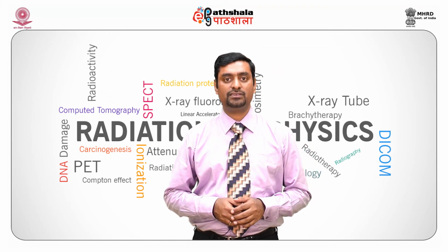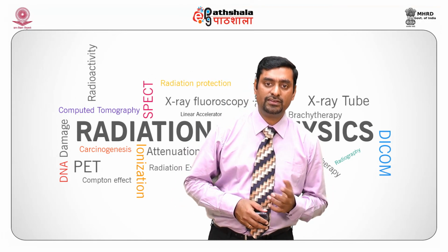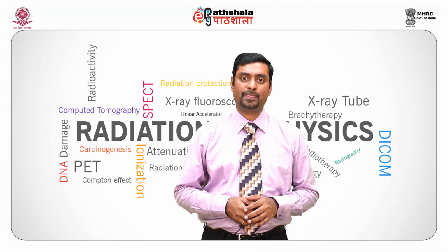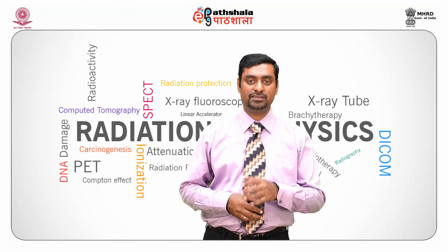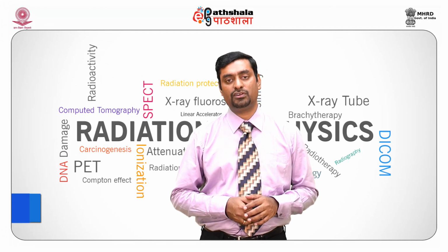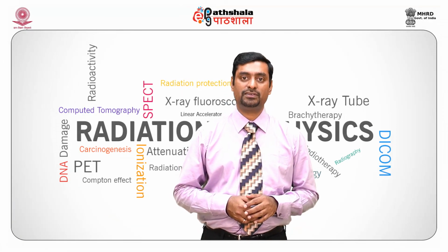The indirect flat panel detector uses a scintillator crystal and a photodiode array of amorphous silicon to convert X-rays to light and then to electric charge to form a signal which can be viewed on a monitor. In the case of a direct flat panel detector, amorphous selenium is used to convert X-rays to an electric charge. Hence, it is a direct charge. We do not have a conversion of light to electron. Hence, the digital imaging systems used for mammography these days have direct flat panel detectors, which have improved spatial resolution compared to the indirect flat panel detectors.